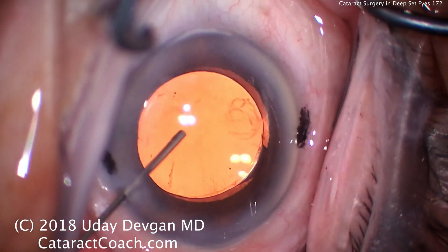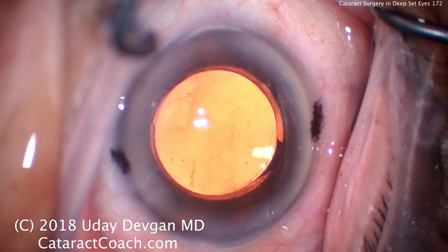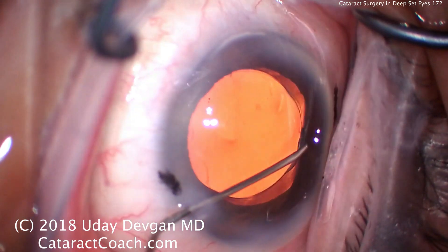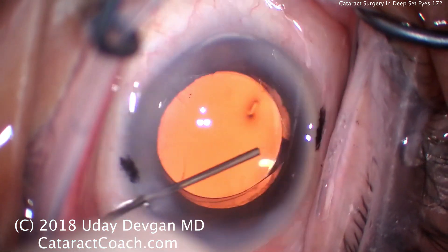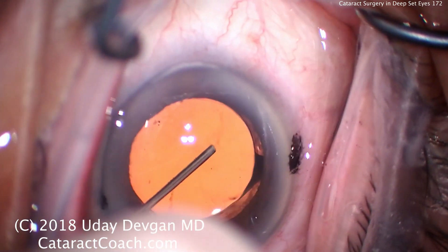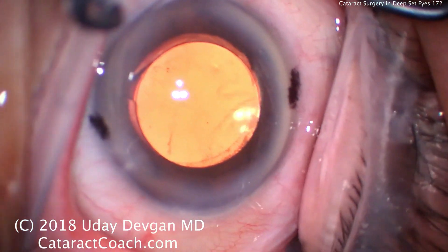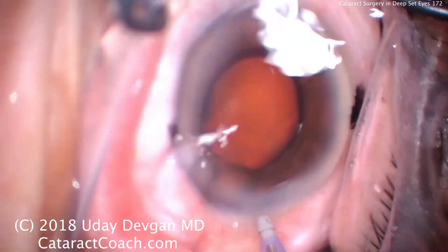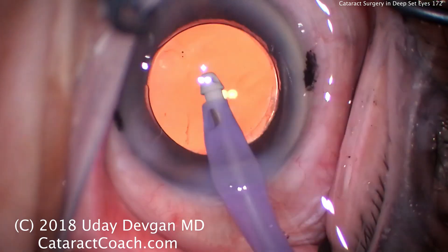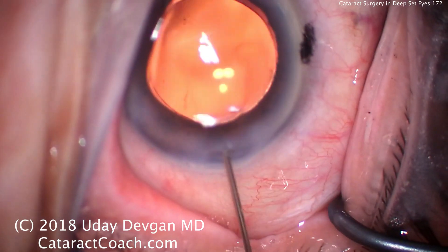The IOL was already in the eye. Do you notice anything else going on? We're using balanced salt solution to wash out the AC. Look at the speculum position, especially on the lower lid — the bottom left corner of your screen. It already came off of the lid there. So this is such a deep-set eye, the speculum doesn't quite fit. There's a lot of lid laxity, and that speculum is partially off the lower lid. The patient blinks a little bit and we'll take out the viscoelastic — whatever remnants are there. But we need to reposition that speculum. Look at that — it's just about to fall off.